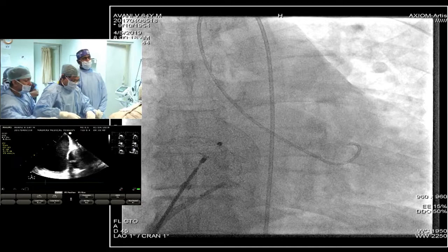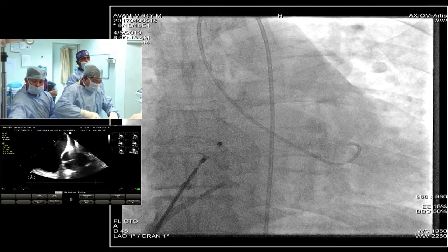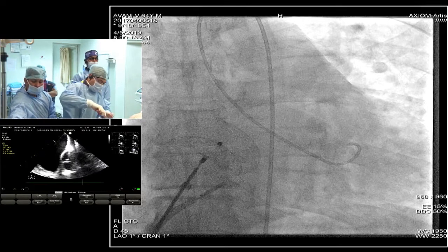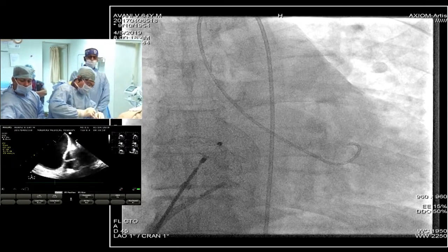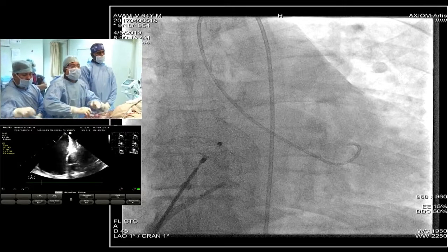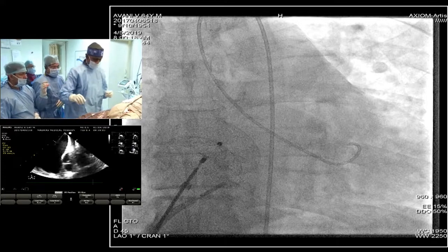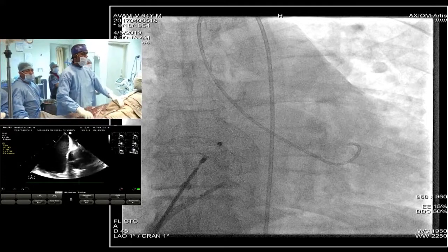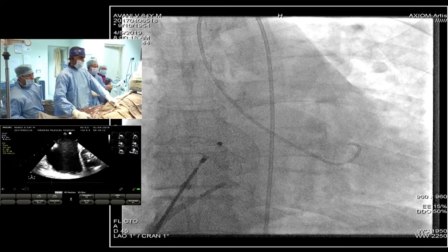So apart from this, in a standard atrial septal defect, we hardly resort to balloon sizing. What has been the practice in Auckland, Cambridge, and all your places, Claire? So we routinely balloon size. Yeah, we do it. I'll pass this along, but I'm quite interested in what you're going to learn from this EDP measurement. I'm sort of not sure about that.